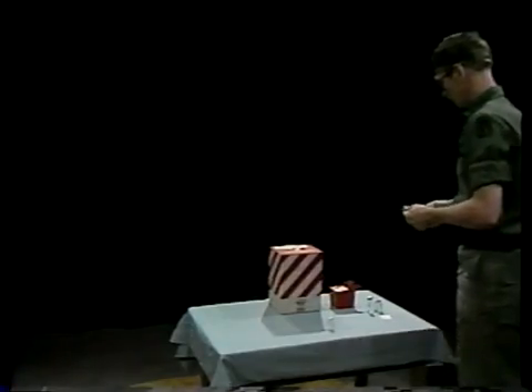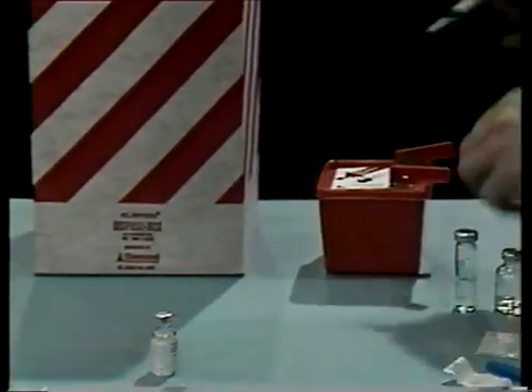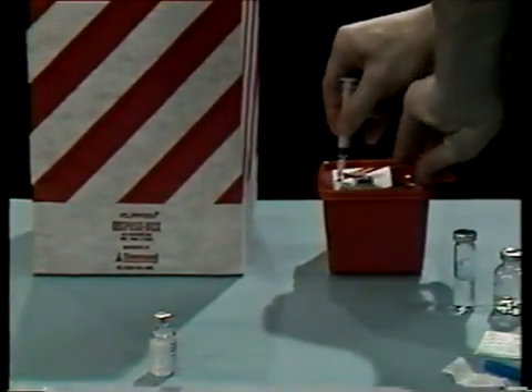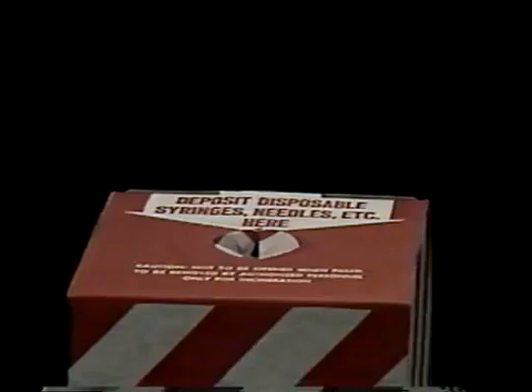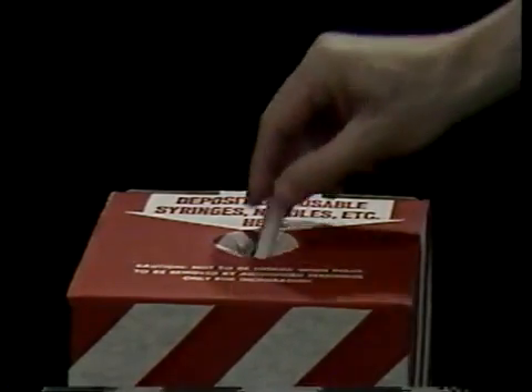Then discard the syringe and needle in the appropriate container. The process of injection takes a very short time — we stretched out this process to make our teaching points. Now practice this task yourself.